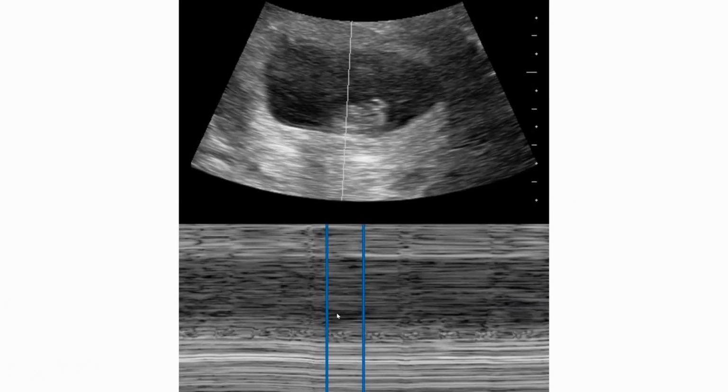On this bottom image, I'm outlining it with my mouse here: this heartbeat, and another one here, and another one here. You want your vertical cursors to be at the same place on each heartbeat, either at the start or at the end is usually preferable. Sometimes if you're too close to the machine, it's difficult to make out the actual heartbeats. Taking a step back will usually help differentiate this.